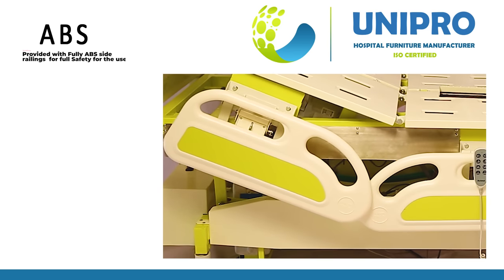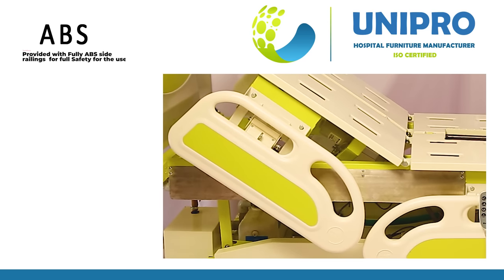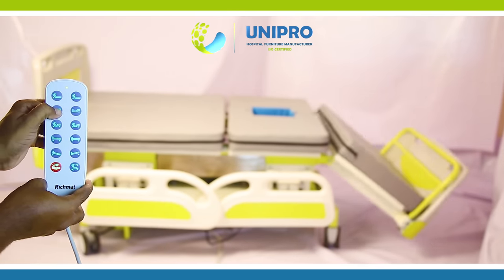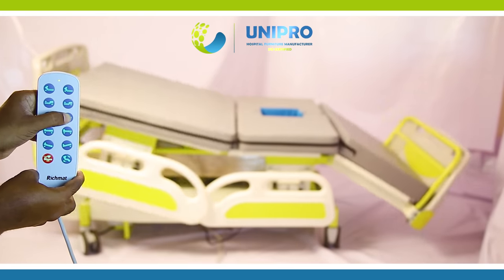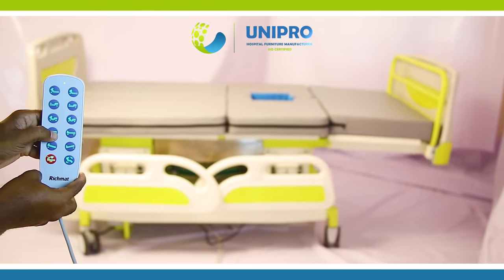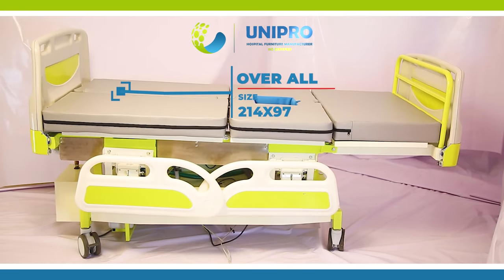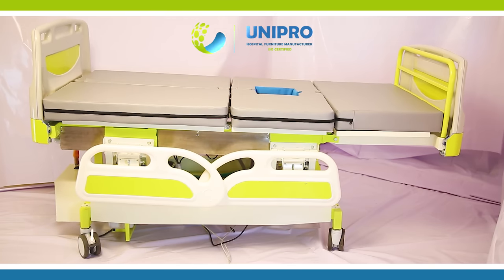Provided with Fully ABS Panel. Side Railings for Full Safety for the User. Detachable ABS Panel Board. Pedal Locking Caster.